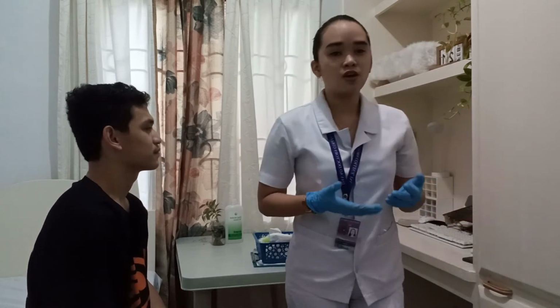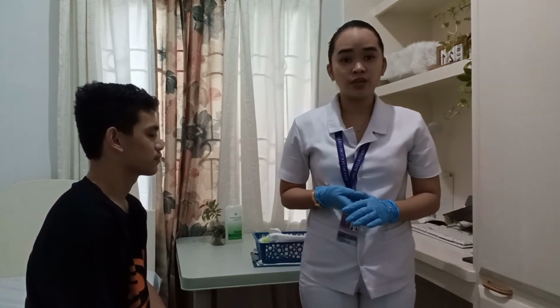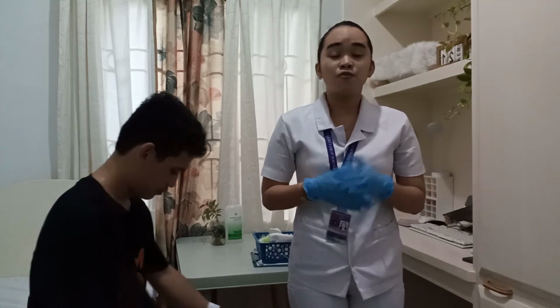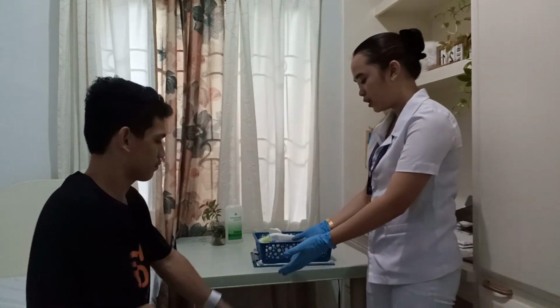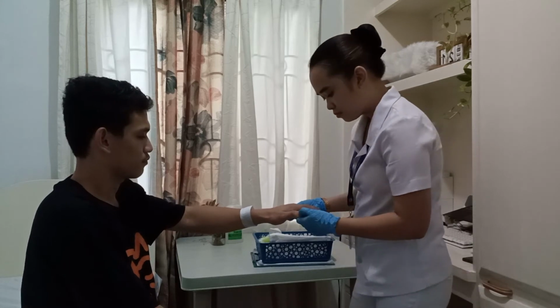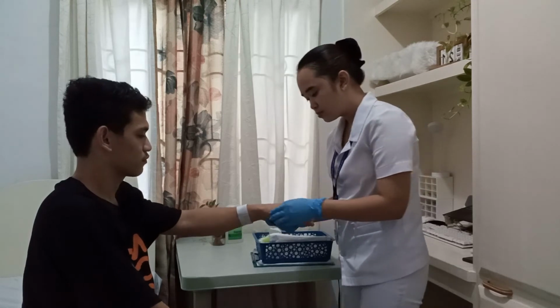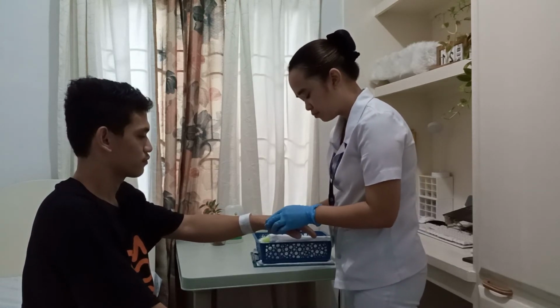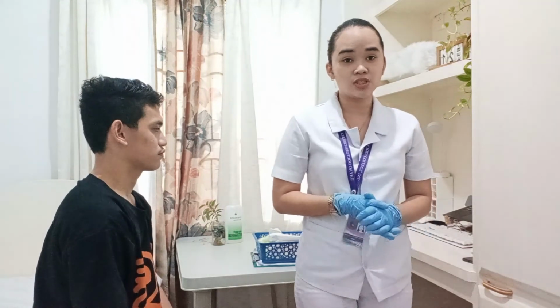Okay. So in assessing the oxygen saturation of my patient, we need to select the appropriate site for the application of the sensor. It could be his index finger, middle finger, or his ring finger. And I also need to check for his capillary refill and also his pulse rate, which is close to the site. Okay, now I'm going to check for capillary refill. Can I see your hands, please? Okay. Now I'm going to check for your pulse. Okay. Now I'm going to disinfect the selected area and also the pulse oximeter to avoid cross-contamination.